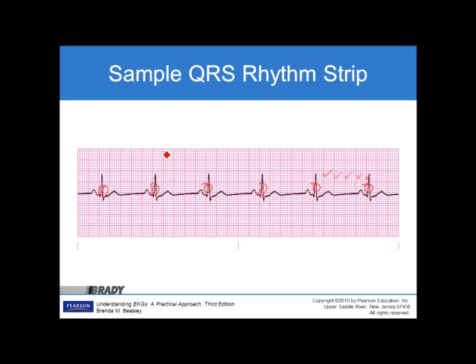It is nice and regular. It looks like it's coming at regular intervals. Is it regular? Both the P waves are regular and the QRSs are regular. They're both coming at regular intervals.